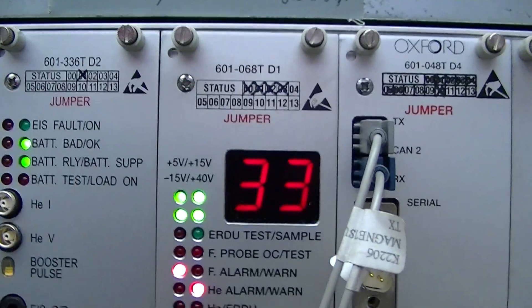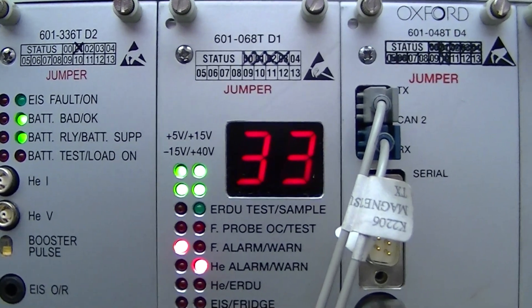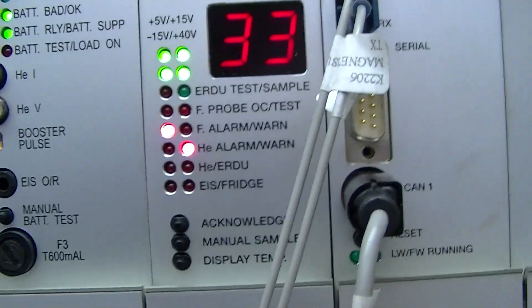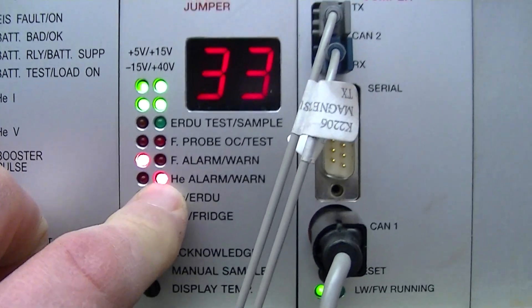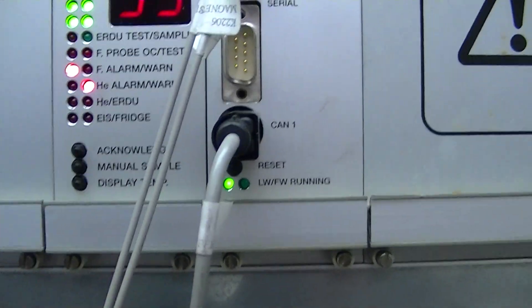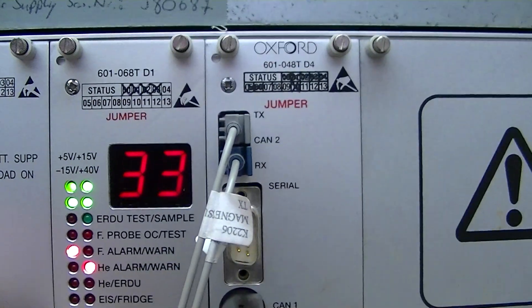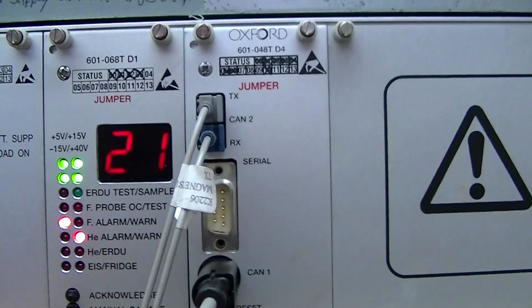Then you move over to the D1. The D1 is going to give you your power supply voltage for the magnet supervision and your current helium level. On this one we have an F alarm and an HE alarm. The HE light right here is pretty much saying that the helium is below the specified level, same with that alarm right there. There's a manual acknowledge, you can do a manual sample, and if you hold the display temp that's going to give you the cabinet temperature in Celsius.